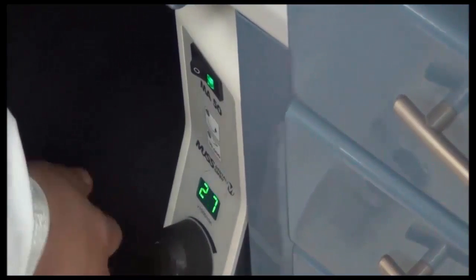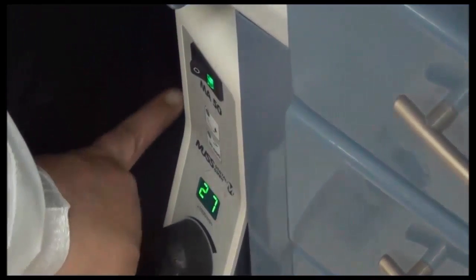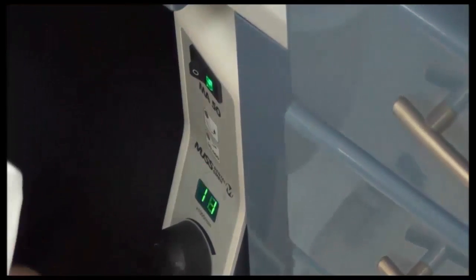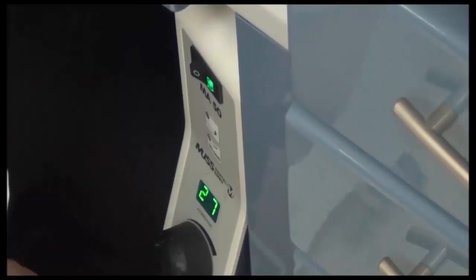So we could put it to the maximum speed, and we're going to use what we call knee control. My knee, I press it against this large button, and it will operate the handpiece automatically.